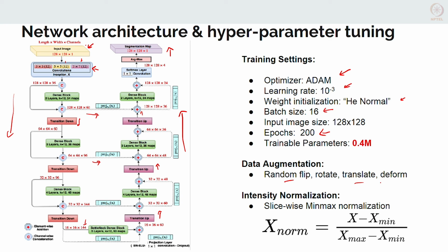This is programmed in TensorFlow, and TensorFlow has its own inbuilt routines for deformation, which have parameters that you can tune so that deformations are not too large and do not make the result unphysical. So, you can't randomly deform the heart. Remember that it is an anatomy we are looking at, so we produce deformations only within the confines of the problem.